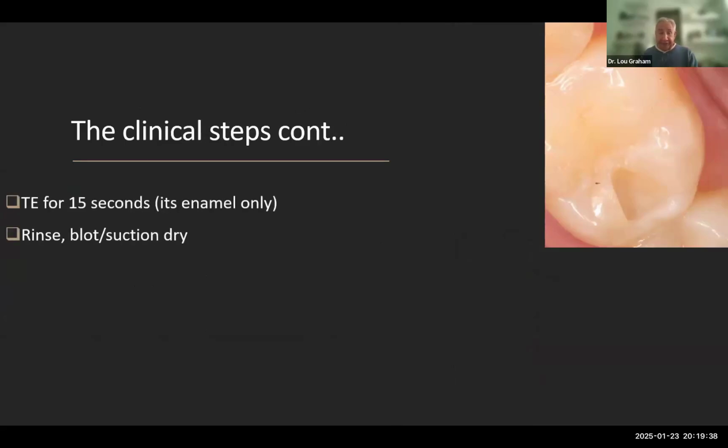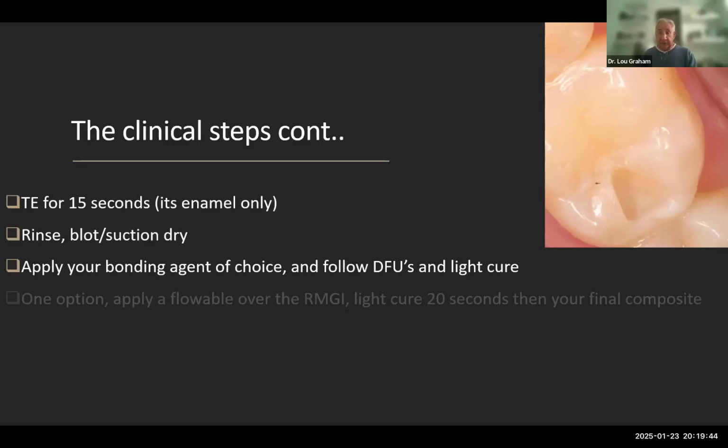I'm not worried about dentin etching. Dentin's all covered up. I'm going to rinse, blot dry, suction dry. Apply my bonding agent like I just shared with you. Light cure my resin for probably 20 seconds. I pretty much always minimum do 20 seconds moving my light.